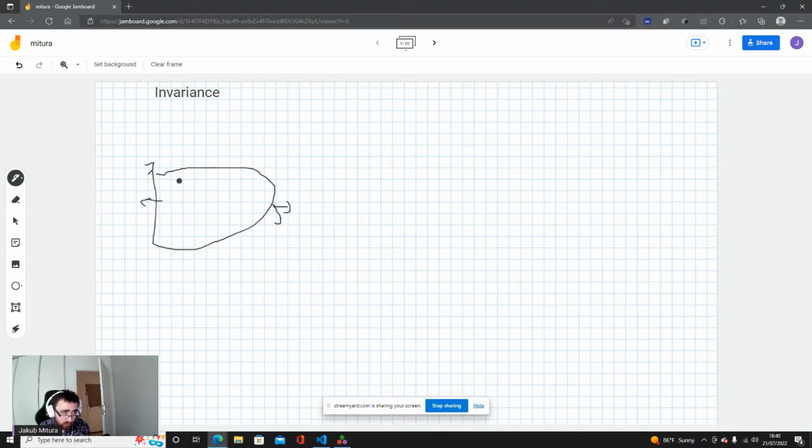And some intensity modification, because depending on the imaging, it would be intensity in the case of MRI and density in the case of CT scan. All of this can change, and we know that it can change because this is logical. The liver can move, the person is breathing, the person can be bigger or smaller, the person can be obese. And when the person is obese, they will have a lot of fat, and the intensity and the radiolucency will change.